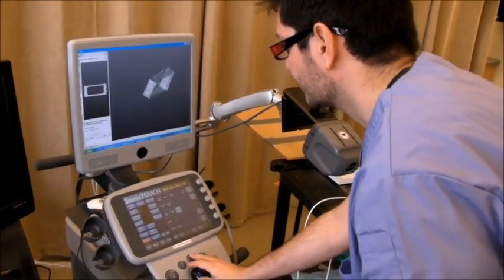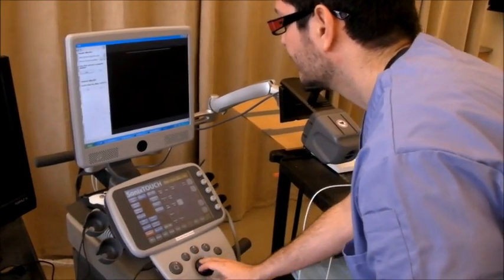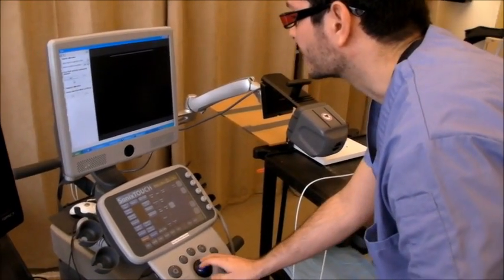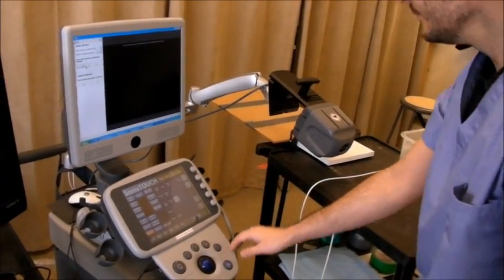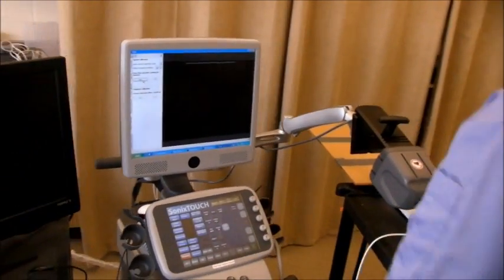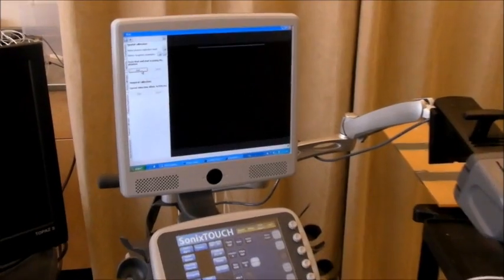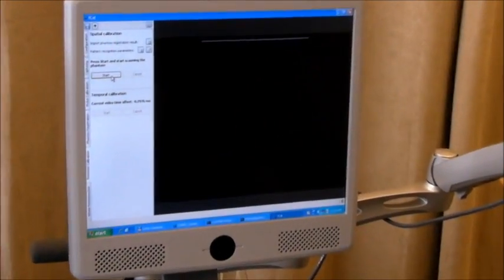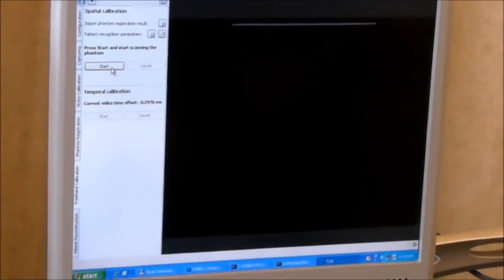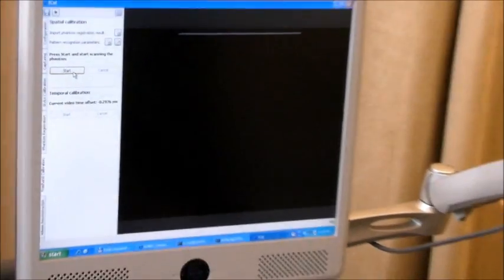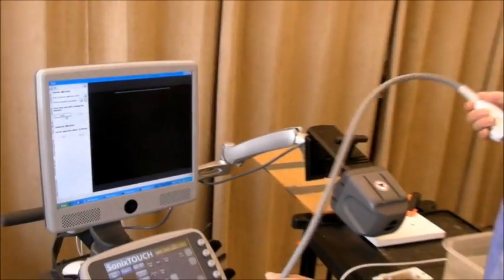We can proceed to the probe calibration phase. This is very important, because this is the step where the image to probe transform is computed.